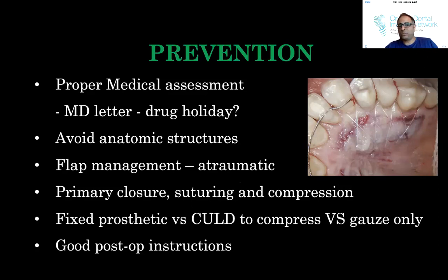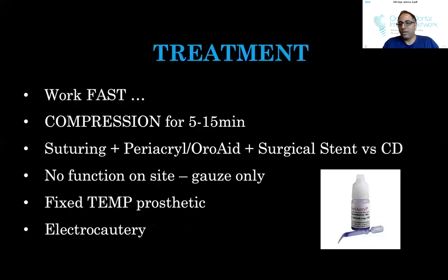And then again, good post-op instructions, right? So again, you'll see from this picture, I harvested a connective tissue graft. And some will say it's overkill, but I will suture with compression sutures, I will add Periacryl, and I'll also use a surgical stent because I don't wanna get the call, right? So just do whatever you can.